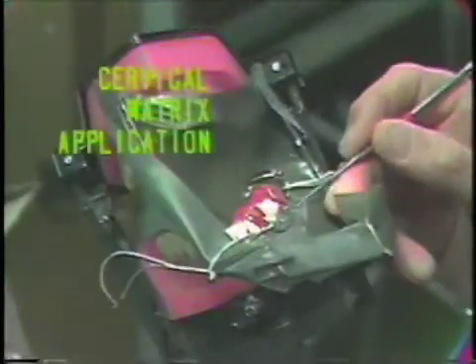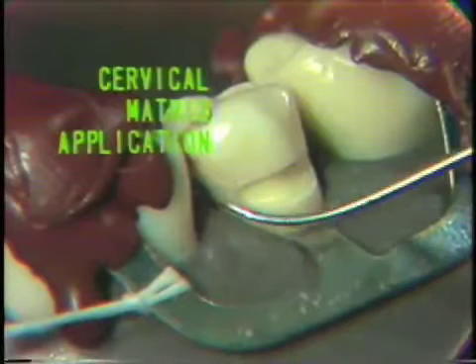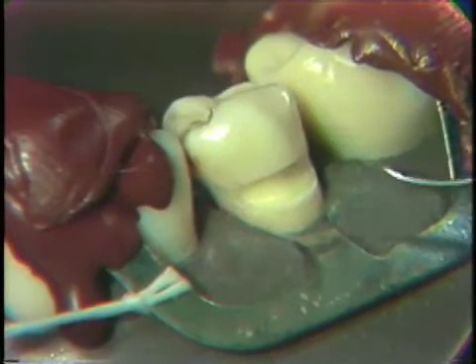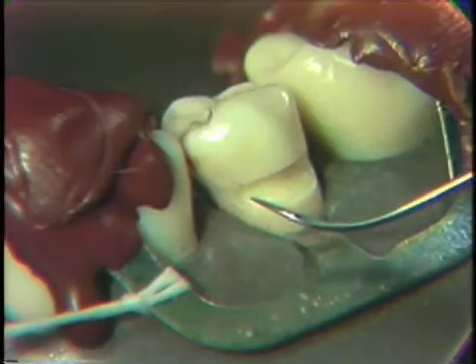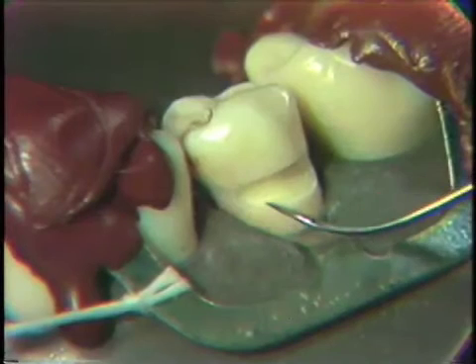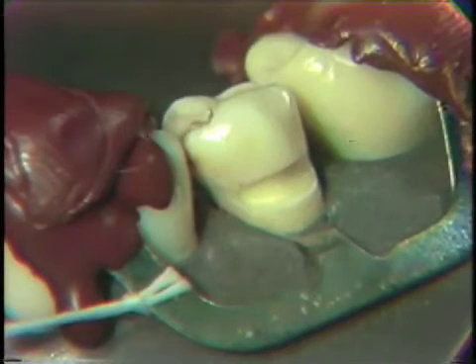There are times when the decayed area will extend into the dental area far enough lingually that causes us to cut a cavity preparation that will include that decayed area, but might complicate the packing of the amalgam since it is extended so far lingually. To facilitate this situation, oftentimes we will employ a matrix for the class V amalgam restoration.